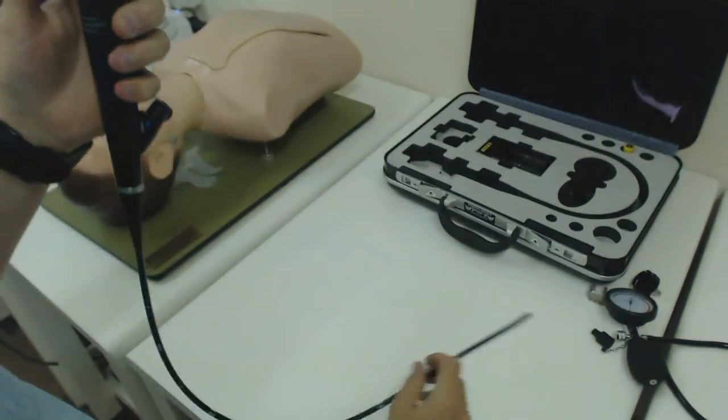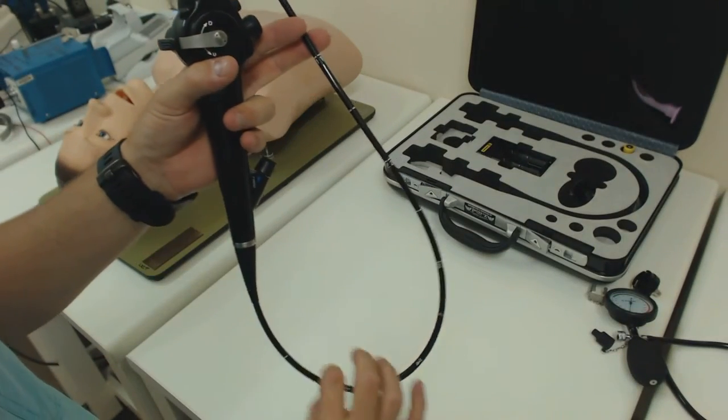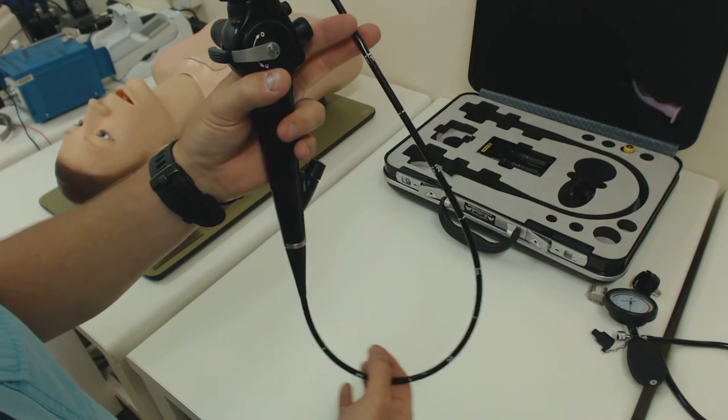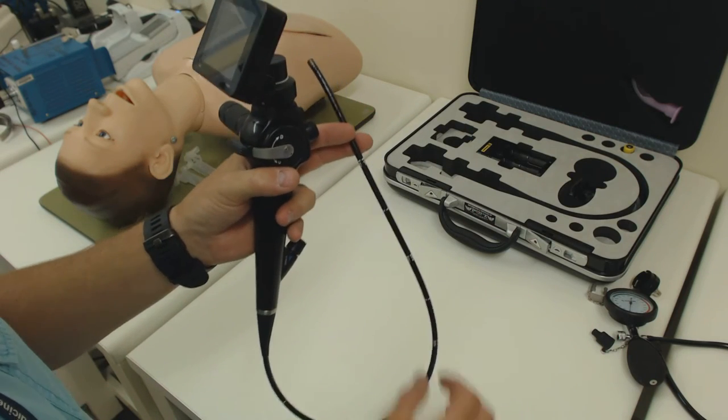Now the scope is fully assembled and we're ready to operate it. If I was going to use this clinically now, I would put a thin layer of lubricant on the outside of the scope and I would preload my endotracheal tube ready to go.